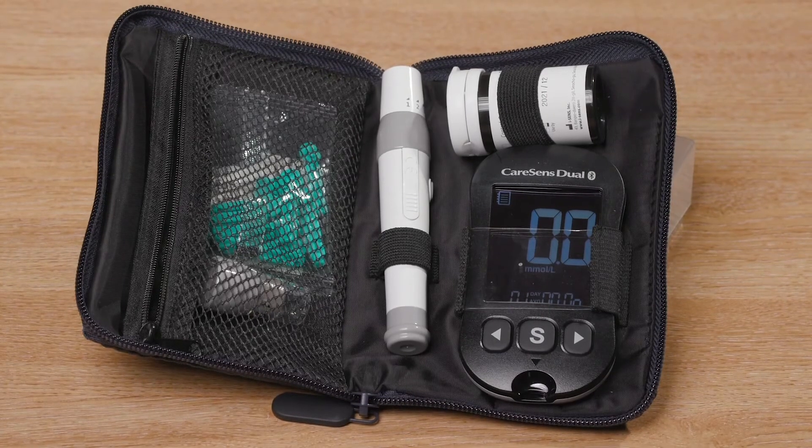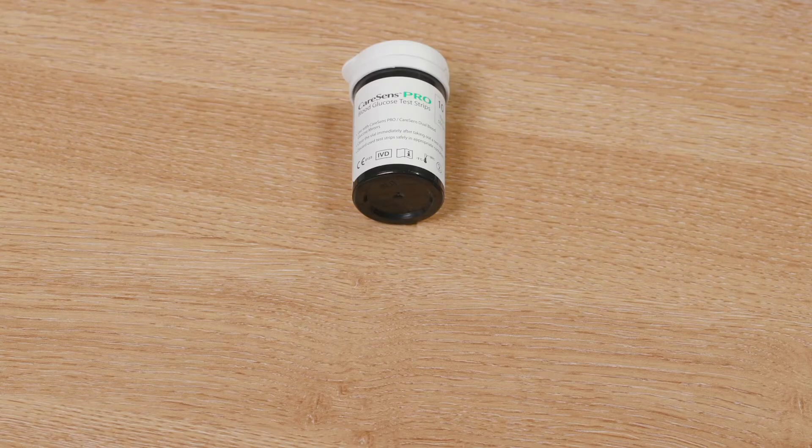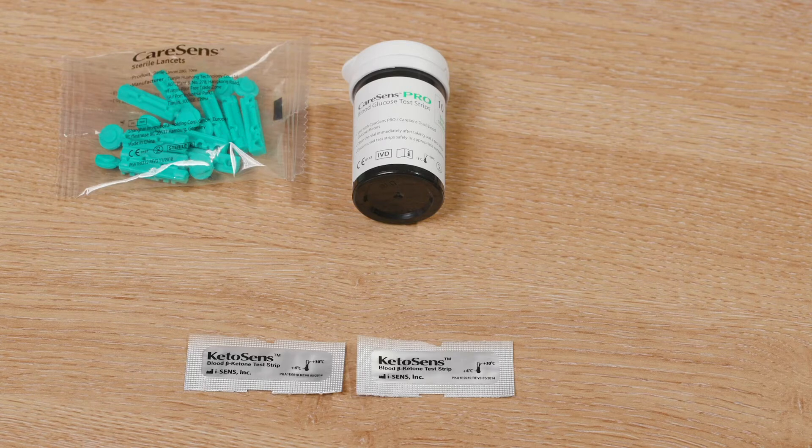Your CareSense meter will have been delivered to you in the ward. Please take the pouch from the box to familiarise yourself with the equipment inside. Once you're home, you'll be required to order blood glucose test strips, lancets, and ketone strips on your repeat prescription. Before you leave hospital, the diabetes team will be in contact with your GP with the new items to be added to your prescription.